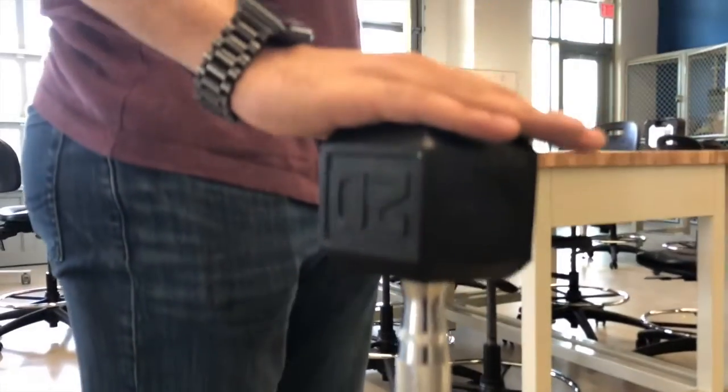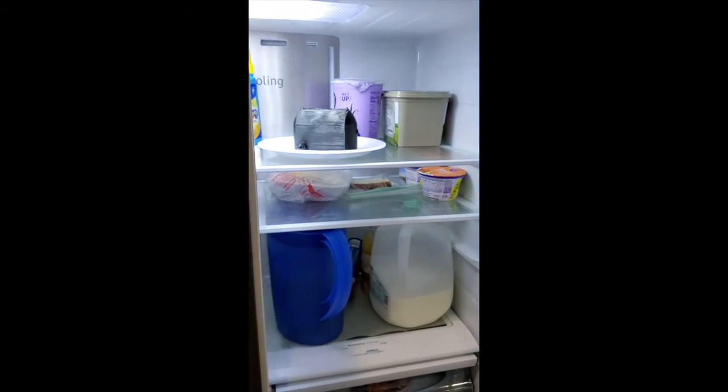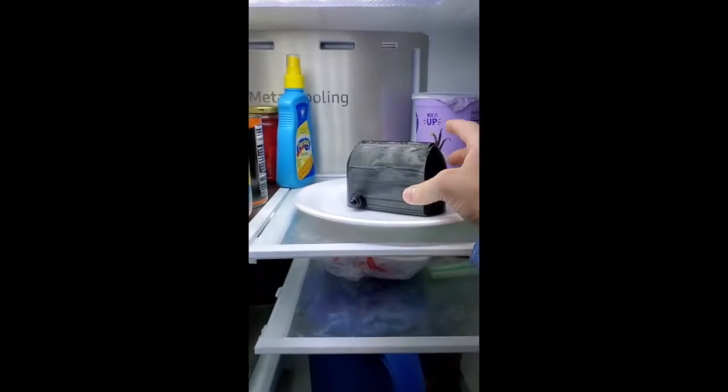Yep, definitely still works. Turn it off. There you go. To test resistance to continuous stress, the PIVP withstood 60 pounds of force for more than a minute. Our design withstood near freezing temperatures, just below 5 degrees Celsius, for 30 minutes with no effects on functionality.